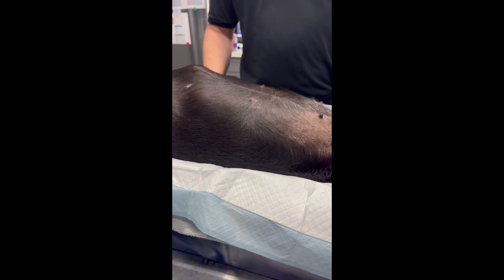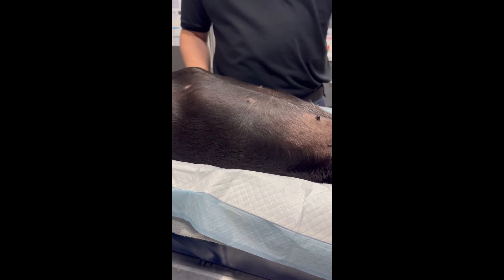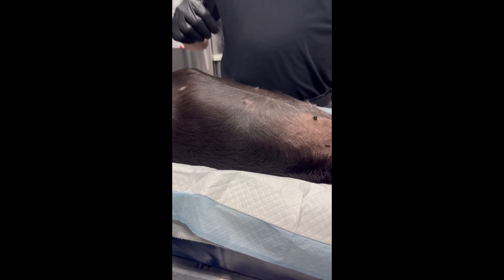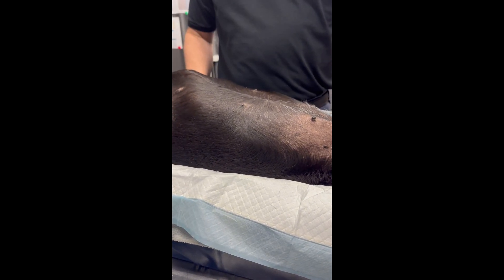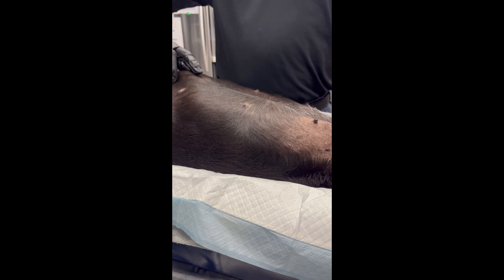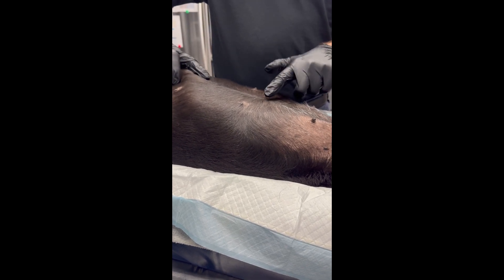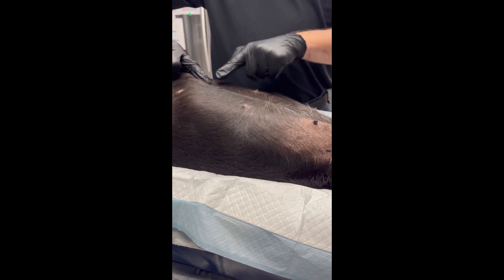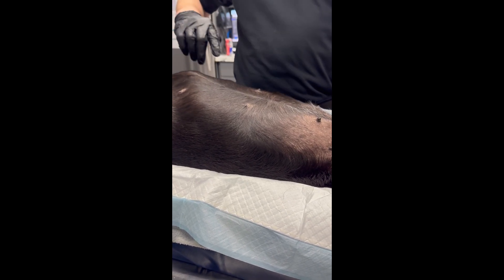Dr. Mark here. I'm going to demonstrate how to give an intraperitoneal injection within the falciform fat pad. We have this dog in a trough laying in dorsal recumbency. What you want to find is the point of the sternum and the umbilicus — these are the two landmarks we use. We know that the falciform fat pad sits right in between there.